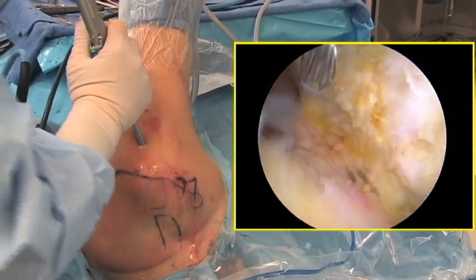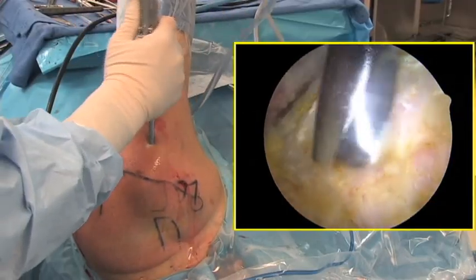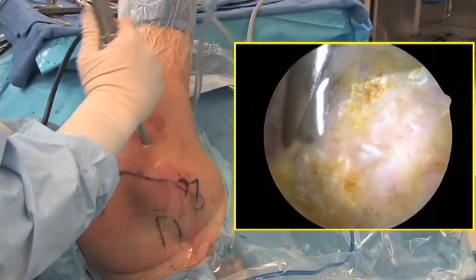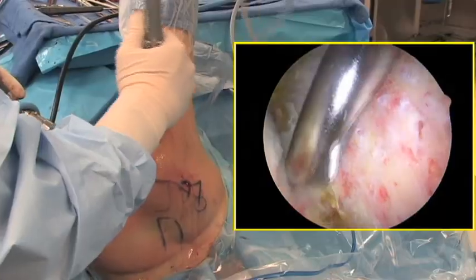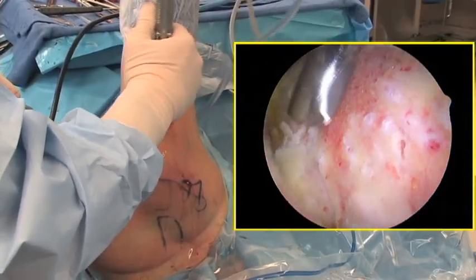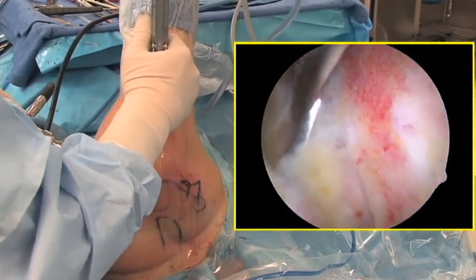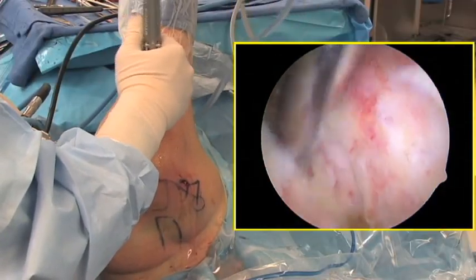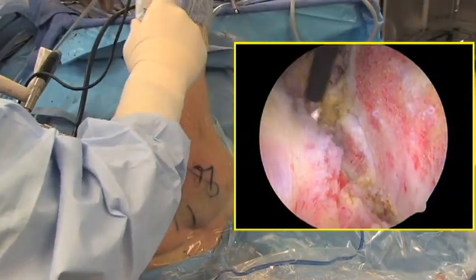An arthroscopic burr is then placed in the lateral portal and used to perform a conservative acromioplasty. The anterolateral edge of the acromion is removed first along with any subacromial spurs. The rest of the acromion is then coplaned down and a smooth surface is created. The distal end of the clavicle is then carefully exposed. Electrocautery is used frequently at this point to maintain hemostasis, and the distal clavicle is coplaned to match the undersurface of the acromion.